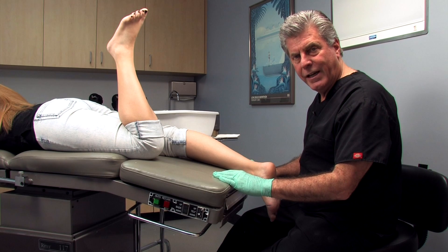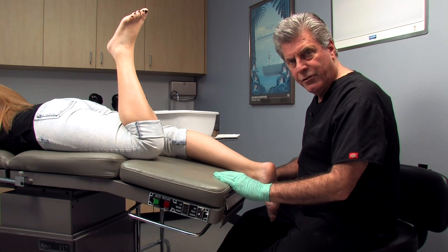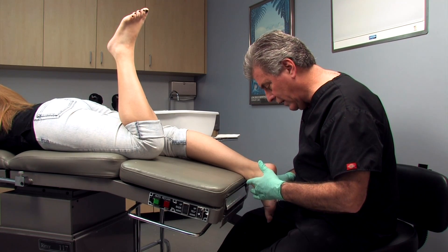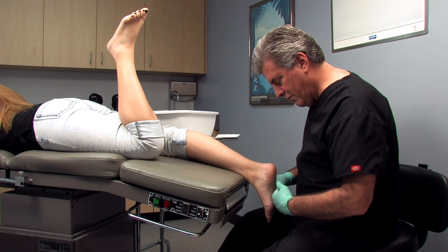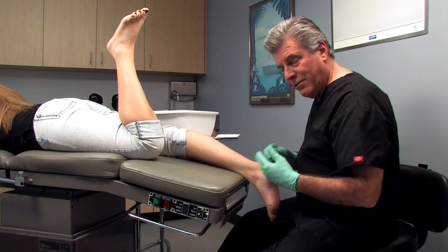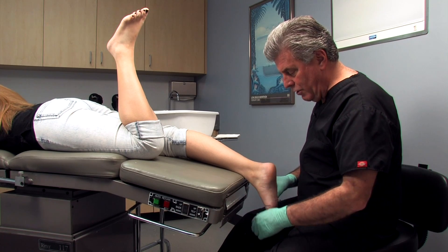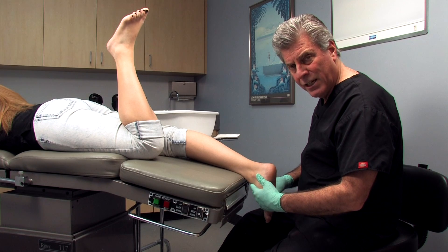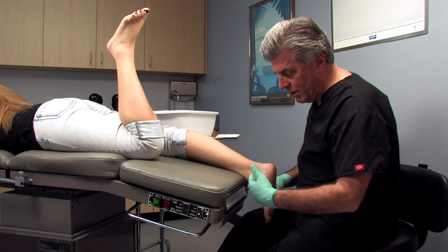Some practitioners prefer to cast a patient prone when doing a plaster neutral suspension cast technique. The advantage of casting prone is you can line up the calcaneus, subtalar neutral, and get a much better viewpoint of forefoot to rearfoot relationship. At the same time, when a patient is prone and you load the mid-tarsal joint, they tend to supinate their foot and fire their tibialis anterior — and the practitioner may not be able to see this because they're prone.